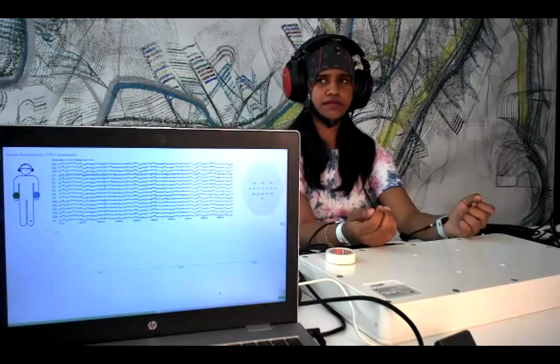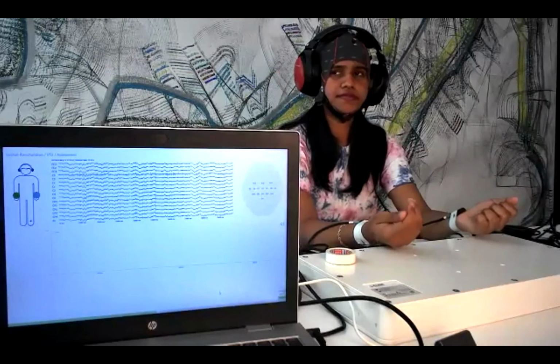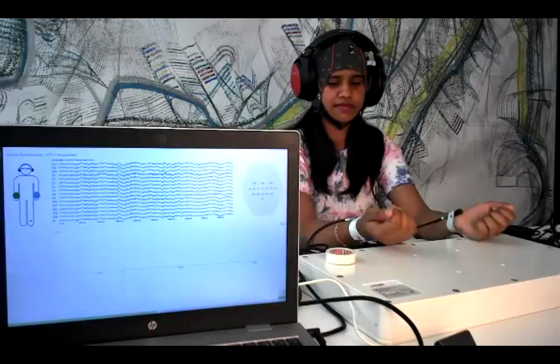As I also mentioned, this task is relatively more complex compared to the VT2. So let's see how Vaishali will perform. Okay, so are you ready? Okay, so we'll start with the right. Let's go.